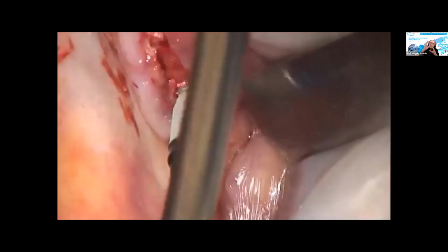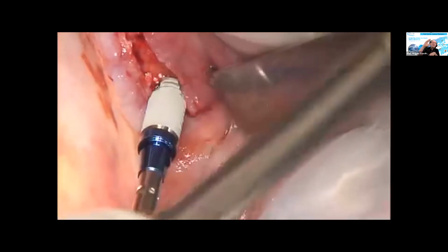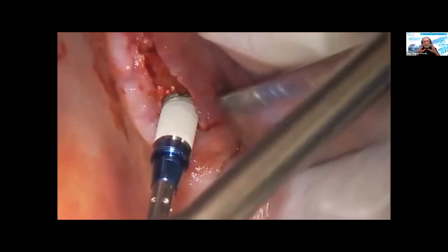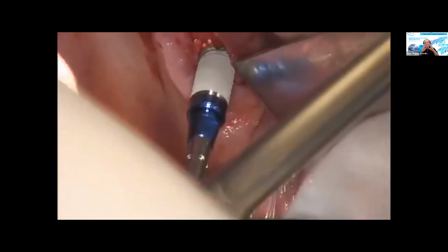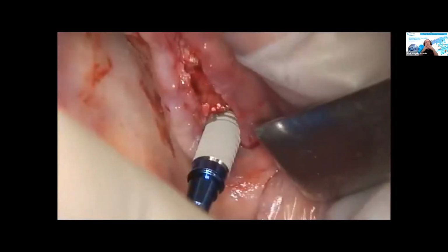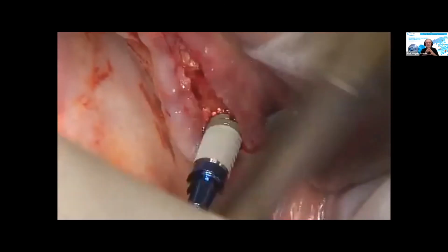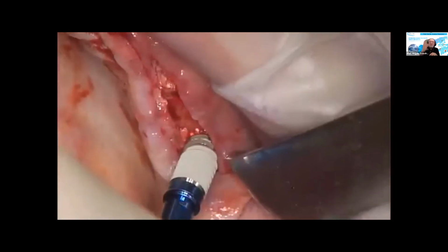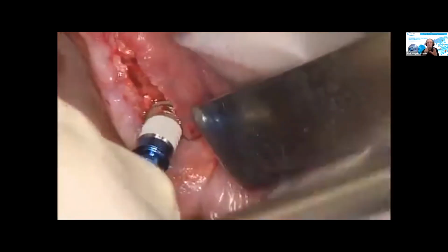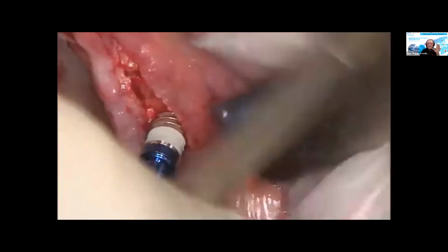Now, another very important issue is when you fill the bone graft material and you do not insert an implant, you can be 100% sure by the mathematics and by the geometry, and you always know if you do the intralift, you will always create a minimum 2 cubic centimeter subantral scaffold. Now, but then you take 2 cubic centimeters or 2 milliliters of bone graft, you push it in, and you know you're fine. But if you insert an implant simultaneously, the story is different.